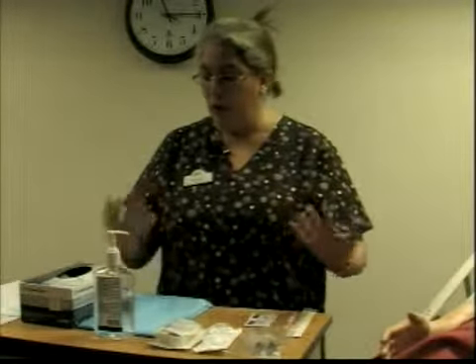As you gather all that information, the next thing is to gather all your supplies. What size of IV catheter you're going to use will depend upon what the therapy is going to be for. If you're starting an IV to transfuse blood, you want to have a large bore, because blood is a lot thicker than fluids, and you want to make sure that you have a site that can tolerate that type of volume and thickness.